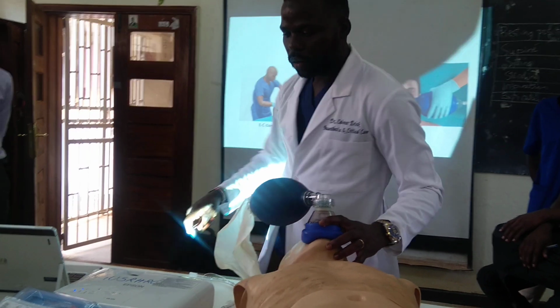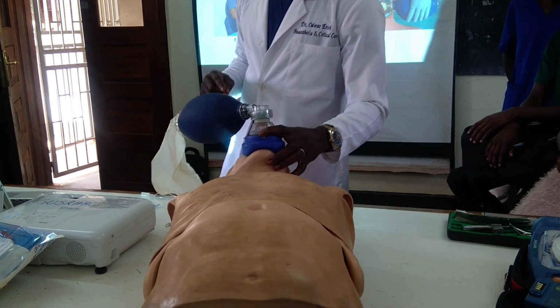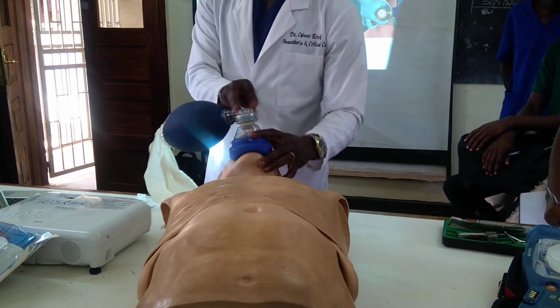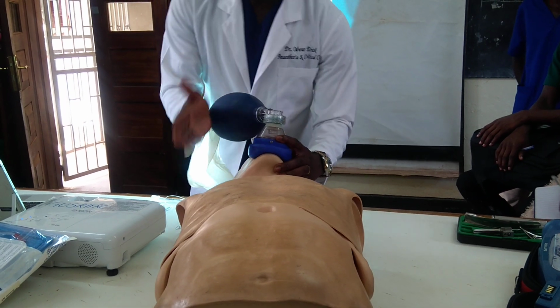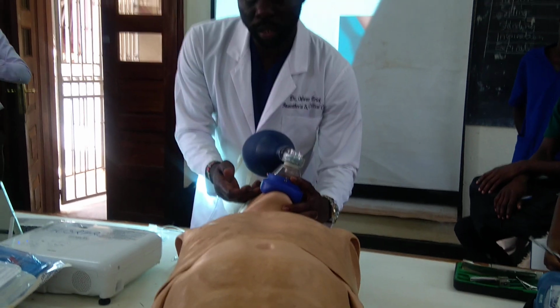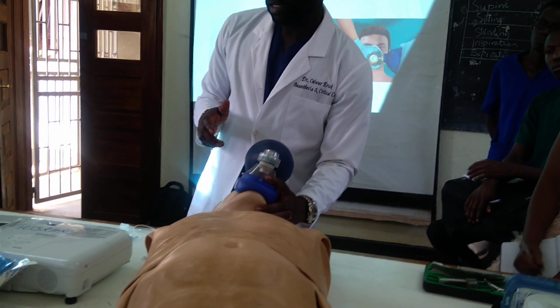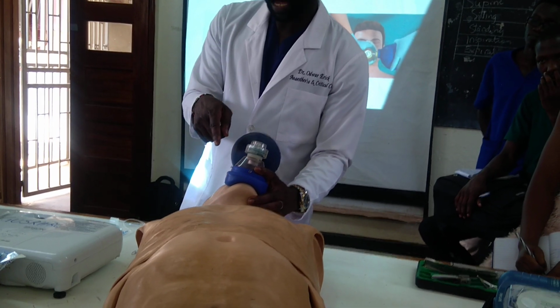That is. Now, if I'm using one hand technique, this is how I'll grab it, and I make a good seal. But if my effort is more this side, I'm going to create a hole here because it's going to bend. And if there's a hole here, this is where the leak is going to be. So if I'm ventilating my patient, it will not be adequate enough. The air is being vented out, not into the patient's lung.